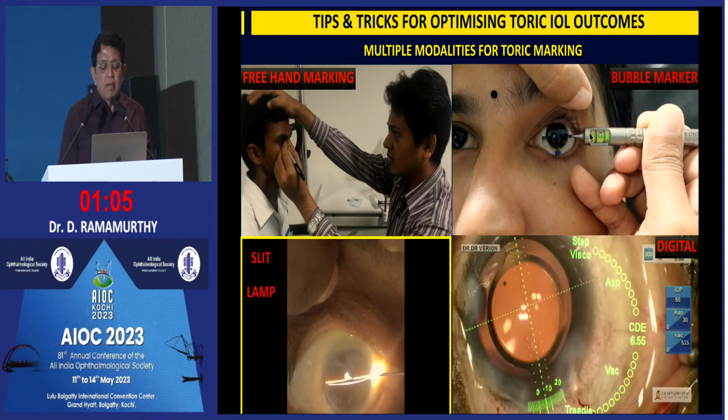Otherwise, for a long time, we have been using this bubble marker, where it has to be absolutely perpendicular, parallel to the floor, and this bubble has to be in between these two lines. You get a mark on the 0, 180 and 90 degrees axis.